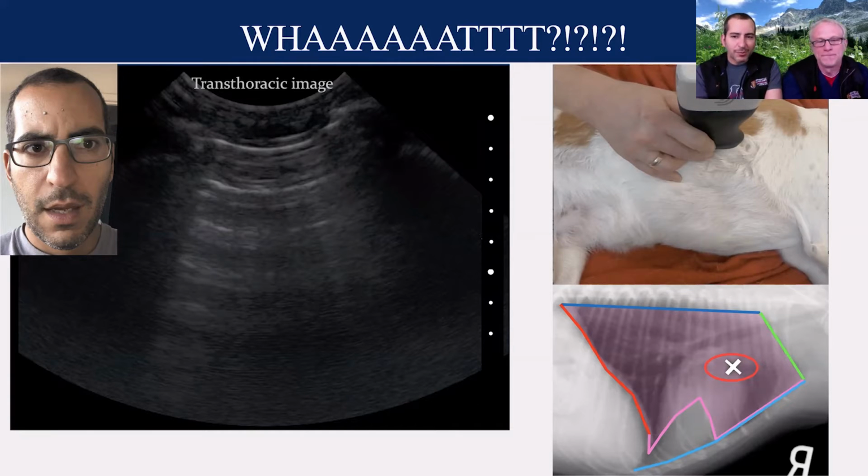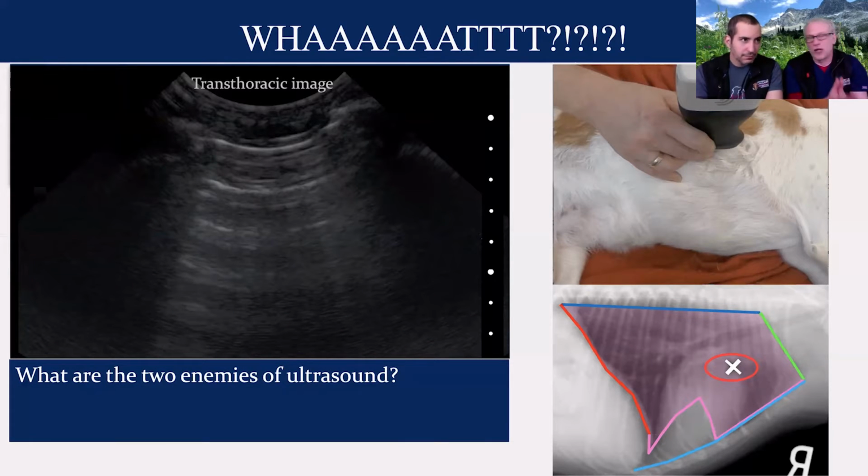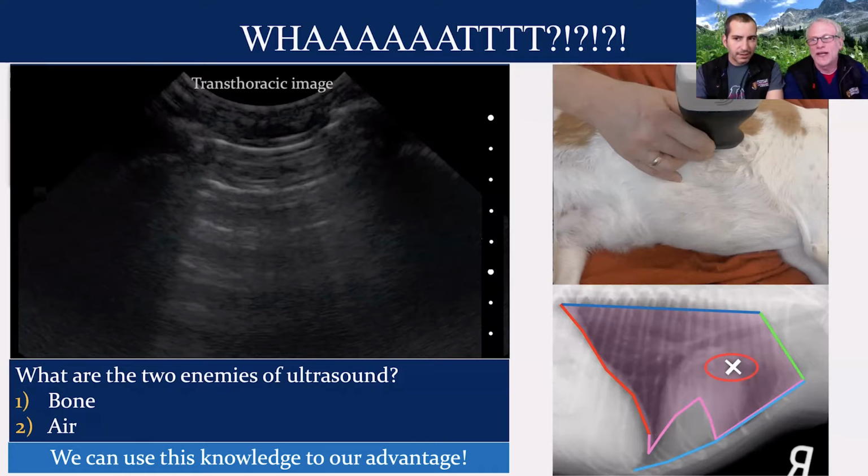Well, let me ask you a question, Dr. Boysen. In the abdomen, everything is soft tissue. Why am I seeing everything here? That is because, Dr. Chalhoub, there are two enemies to ultrasound, and this is why I find this so fascinating. What are they? Well, one is going to be bone. I know that ultrasound beams can't go through bone. You are correct. And what is the second one, Dr. Chalhoub? Well, it's going to be air. Absolutely. So we've got bone and air, Dr. Chalhoub. If you know what your actual enemies are, and you know how to find the site where the probe will interact with those enemies and what we will see as artifacts, we can use that to our advantage, Dr. Chalhoub, and we can figure out what we're looking at and how to interpret it.